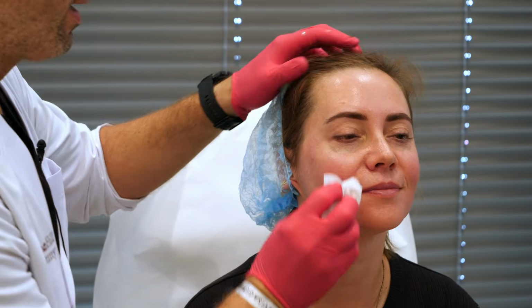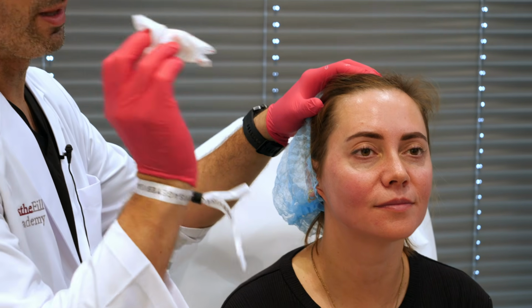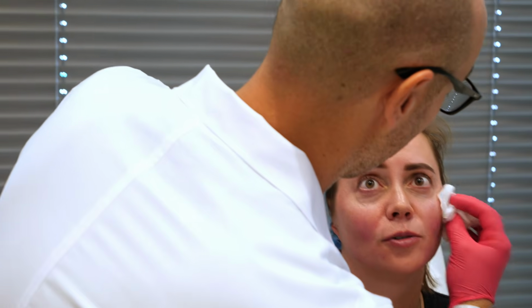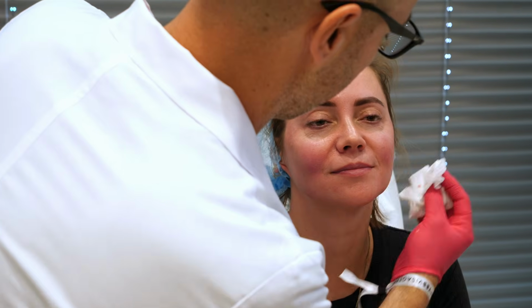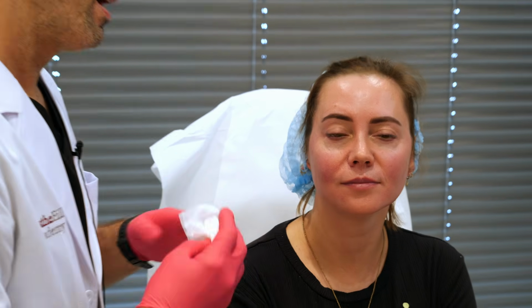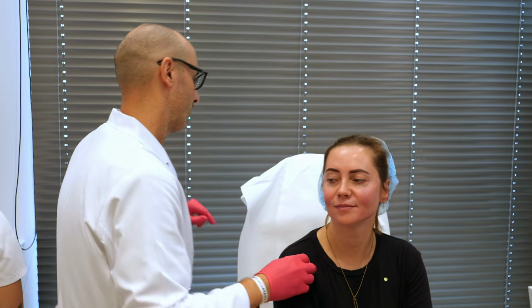We have a little bruising because it's a chlorhexidine with alcoholic solution, and she has a little bit of rosacea. But this is the initial result, okay? This goes down in a few days and goes up in 2 or 3 weeks. Let's go to finish.